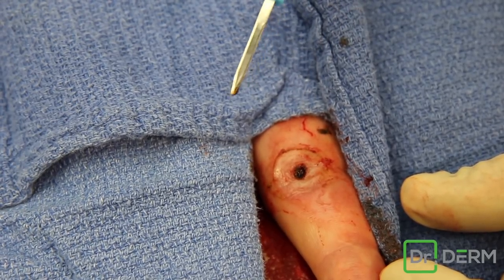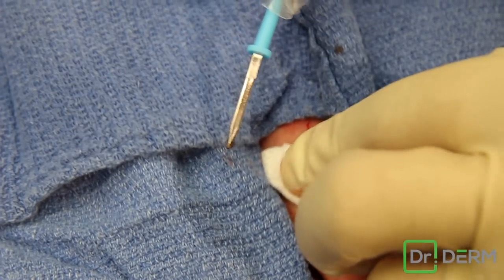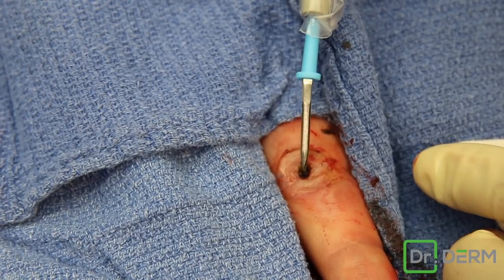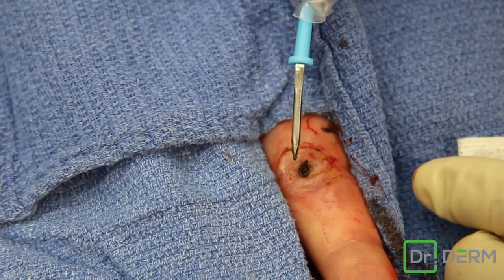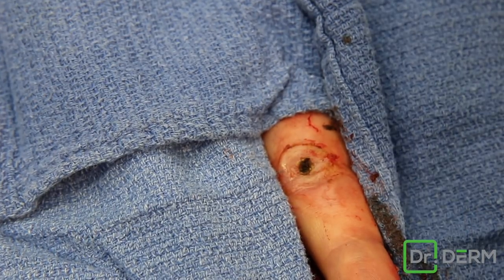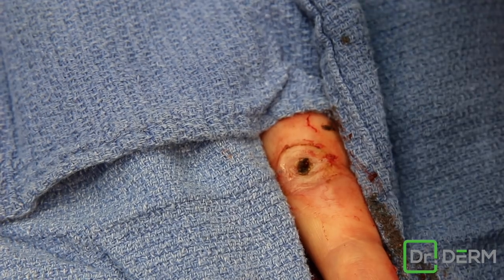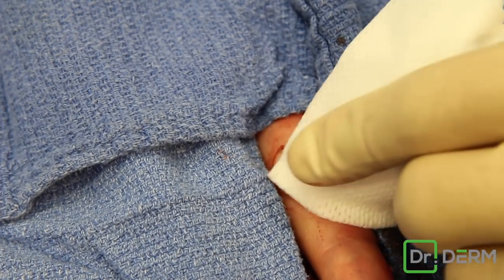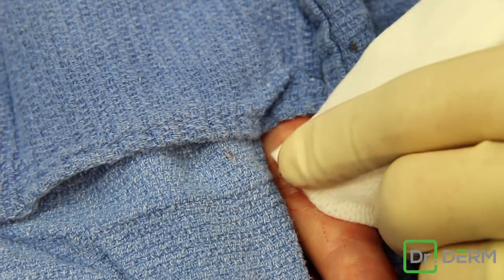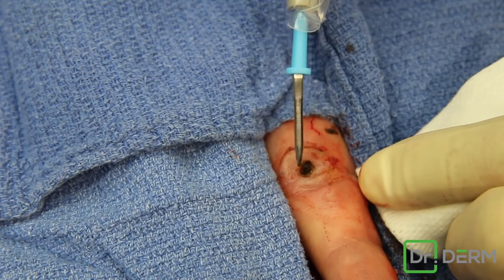The finger's going to heal so good. So that's it — no skin graft. This is just to try to keep it from coming back. Again, that spark is fulguration. It's still oozing a tiny bit more, let me do that one more time. And that had an arterial supply in there if you saw it.